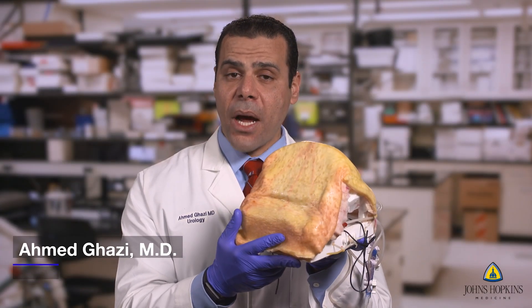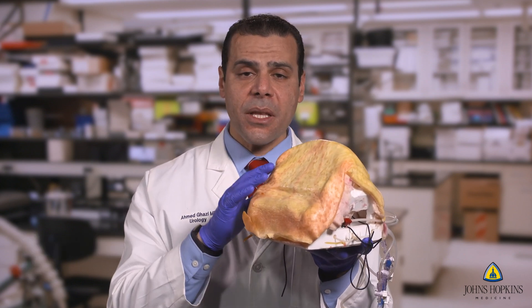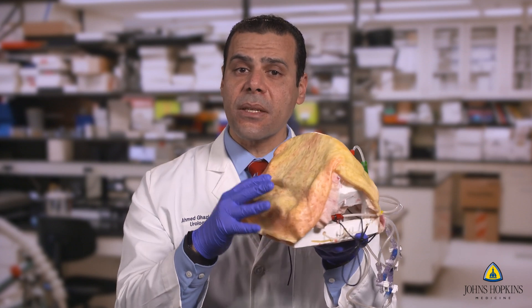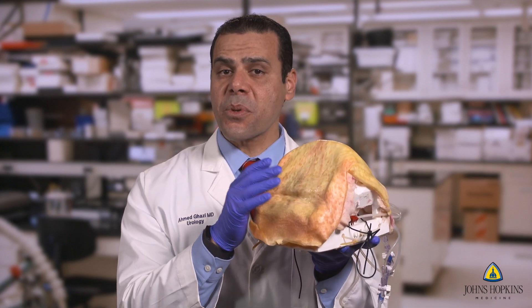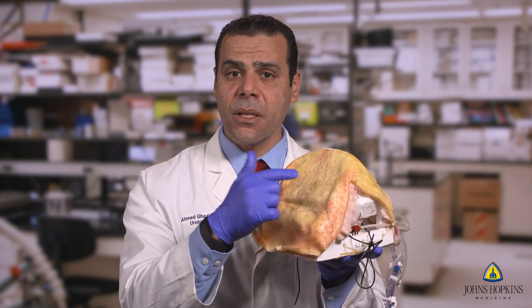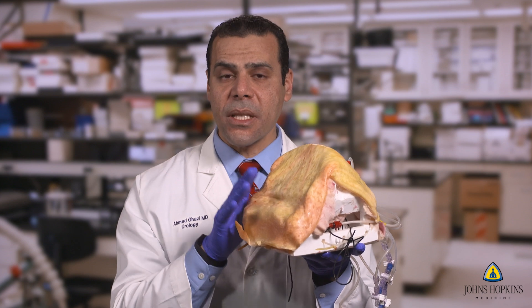This is our robotic radical prostatectomy model designed from a patient's MRI with prostate cancer. We segmented all the bony landmarks and molded in all the soft components. What's unique about this model is it's made for a specific procedure, not for the approach — so you can go transperitoneal, do retzius sparing, or go extraperitoneal, because this is an anatomically realistic simulation.